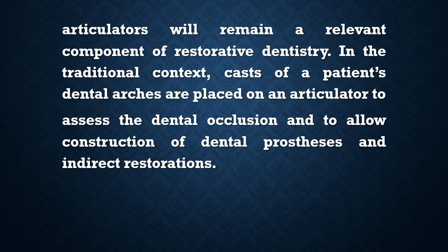In spite of the advancement, the articulator will remain a relevant component of restorative dentistry. In traditional contexts, casts of patient dental arches are placed on an articulator to assess the dental occlusion and to allow construction of dental prostheses and indirect restoration.